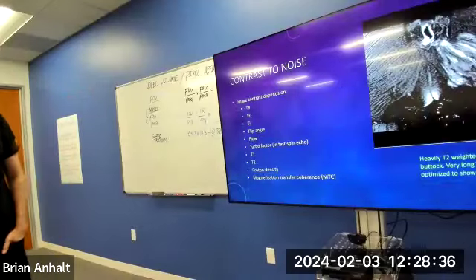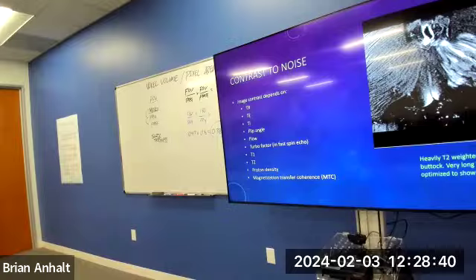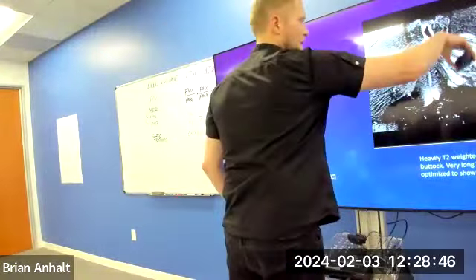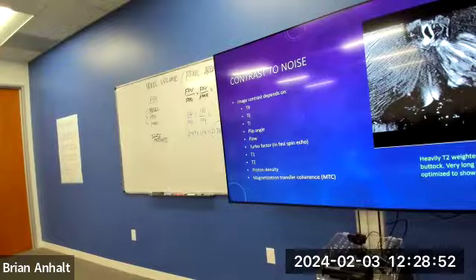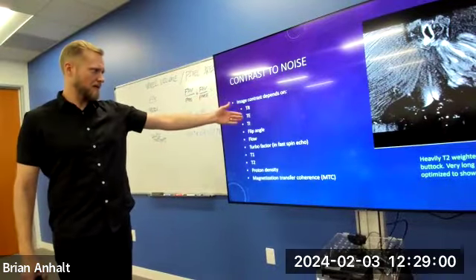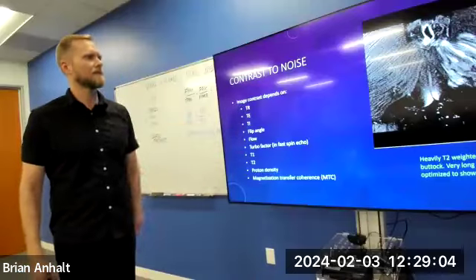Right here as well, that's a lot of contrast, that's a torn glute muscle right there. You're not seeing a lot else, but you can see that tear, it's all this edema here in the tear. The fat suppression of the butt cheeks. But you can see what's going on, right? There's obviously a tear right there. Good contrast to noise. Once again, controlled by TR, TE. Don't worry about all of these others. We'll talk about them later.